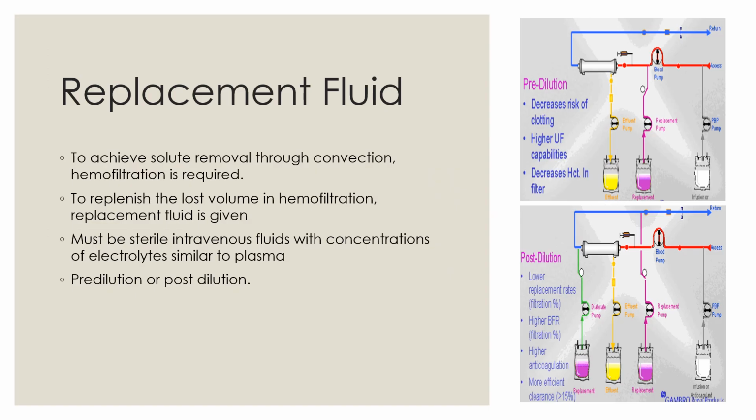Replacement fluid. Pulling large volume of water across the semi-permeable membrane creates a convective current that drags additional solutes. While diffusion is effective at removing most small molecules, convection enhances the removal of small and mid-sized molecules. Thus, convection can be added to enhance solute removal.